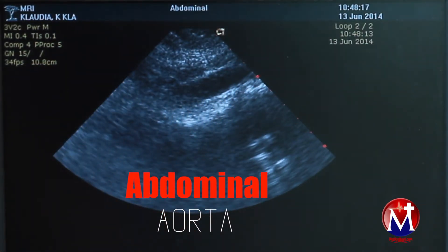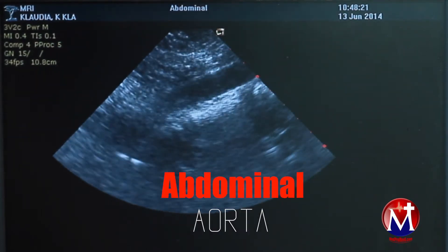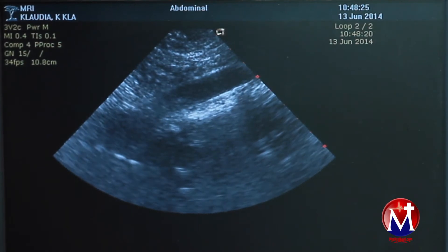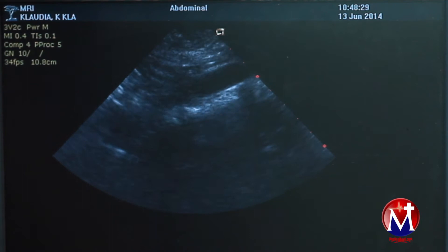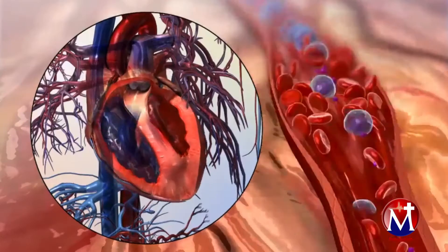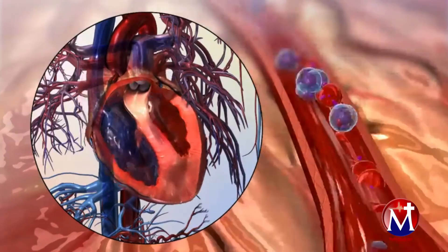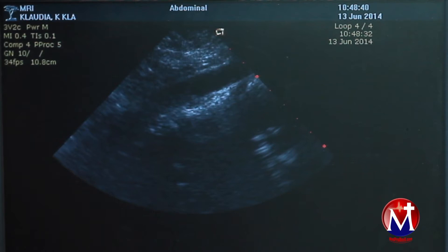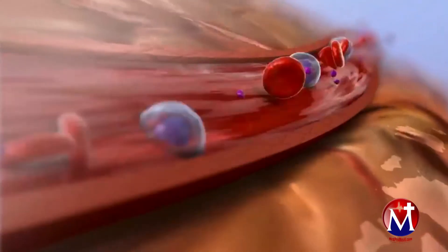That is a picture of the aorta in longitudinal. We can assess the aorta for plaque, areas of narrowing, as well as its size. This is very useful in patients with high blood pressure, known peripheral vascular disease, or diabetes. It enables us to assess blood flow and hardening of the artery.